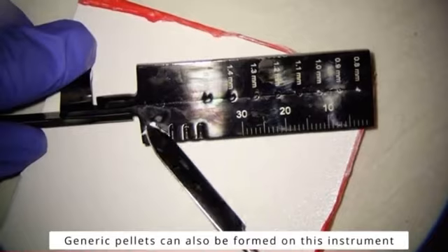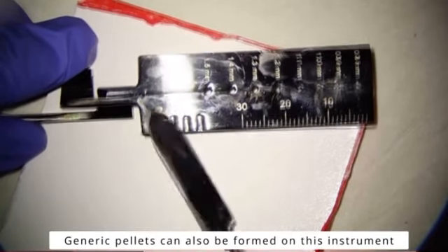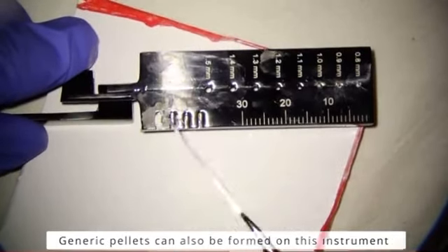Further obturation with bioceramic is required, and the pelletformer also has the ability to create generic-size pellets to aid in placement.